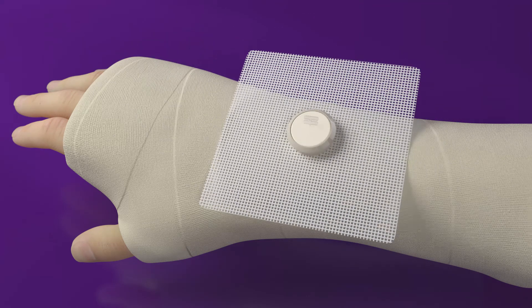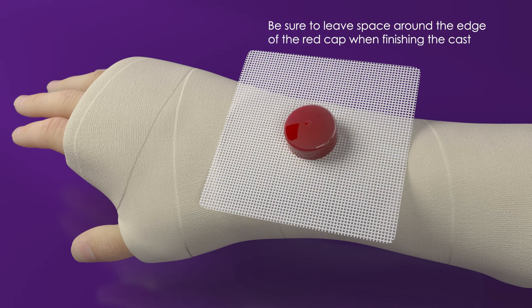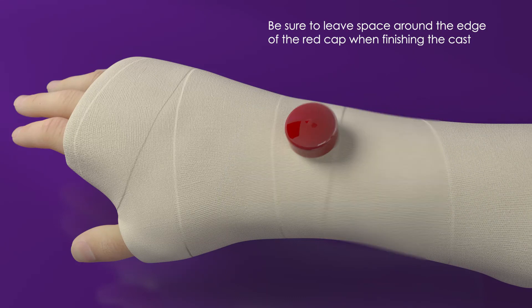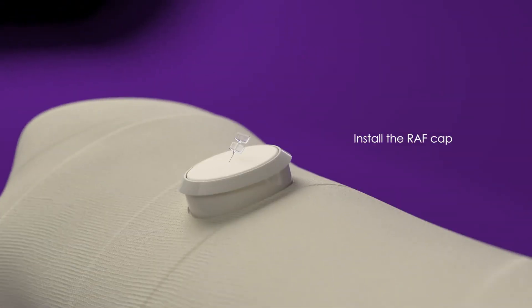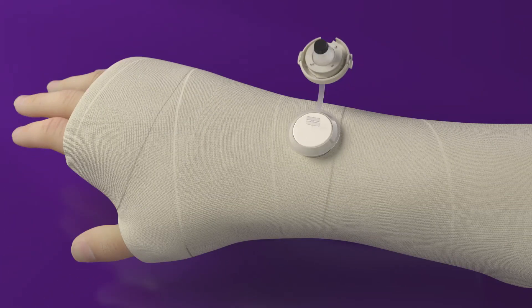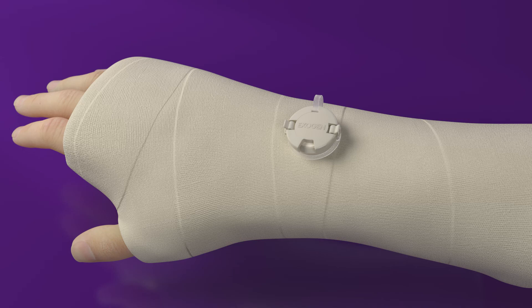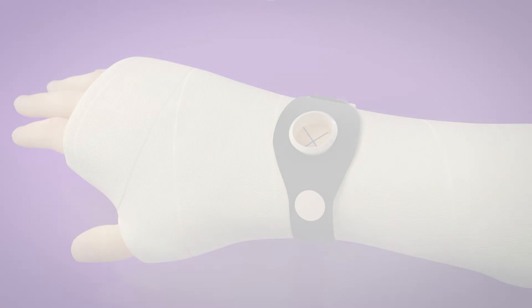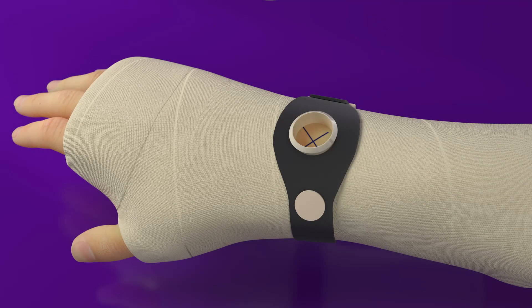Then place the mesh square onto the plastic port to ensure a solid construct. Put the red cap on the RAF and finish building the CAST to cover the mesh around the RAF. To install the assembly on a CAST, position the RAF assembly securely over the CAST window and place the round felt plug into the RAF.